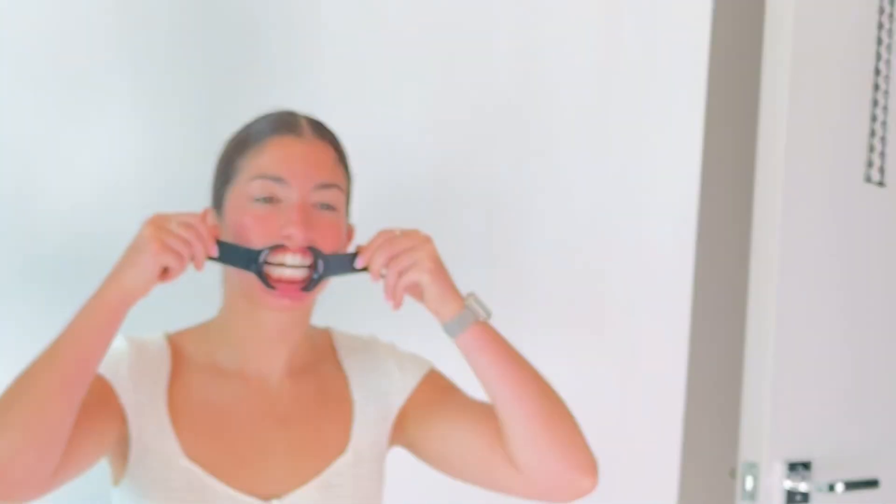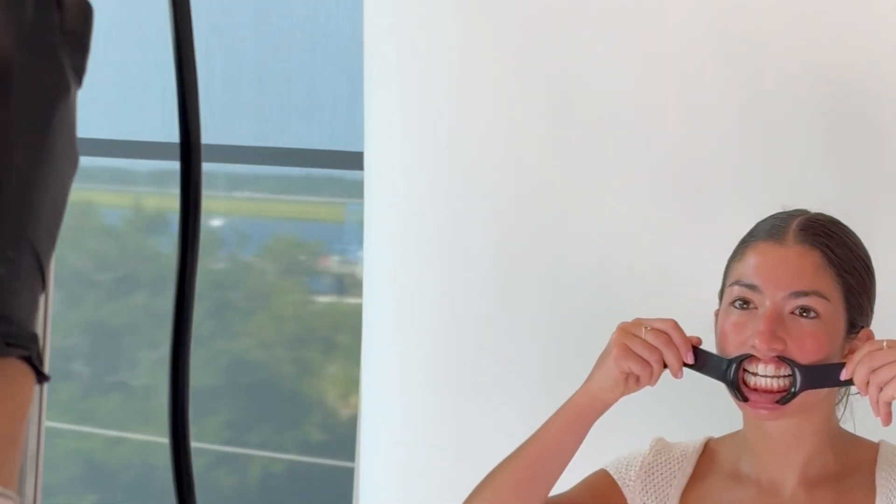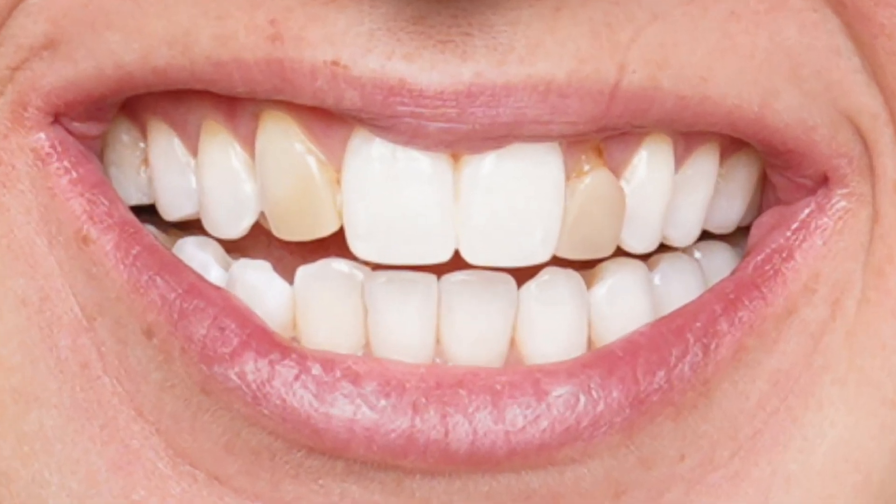I've been getting a lot of questions about this 3D printed veneer case, so I want to dive into it with you guys. Here we have Abby. Abby has been an ortho patient for over 10 years — palatal expanders, moving cuspids into lateral positions, and all sorts of crazy things. Probably trying to correct a skeletal issue with tooth movement and full-blown braces. Not the best of ideas, but here we have her smile, and we can see some things are going on.